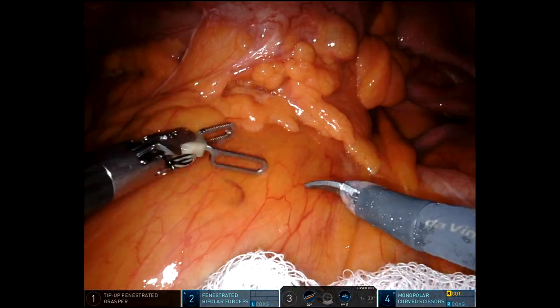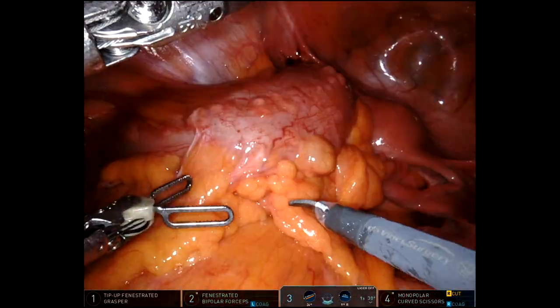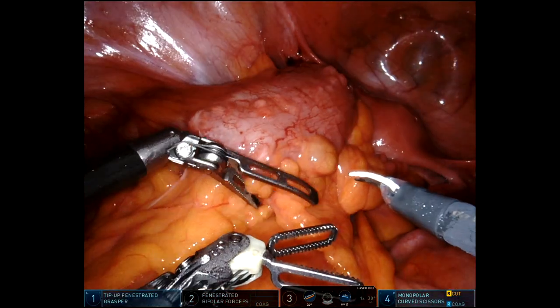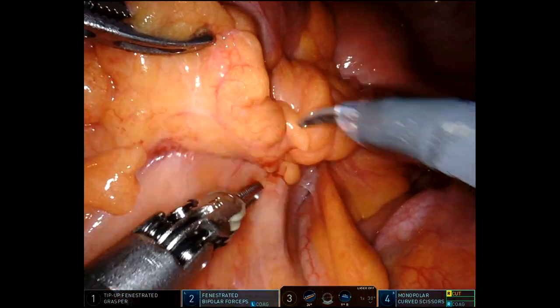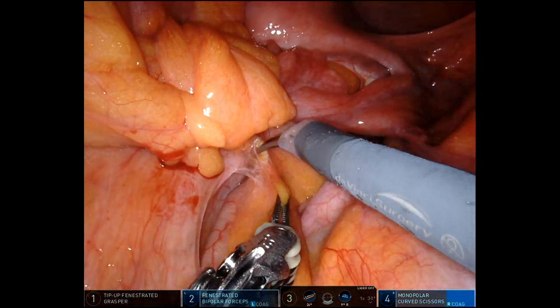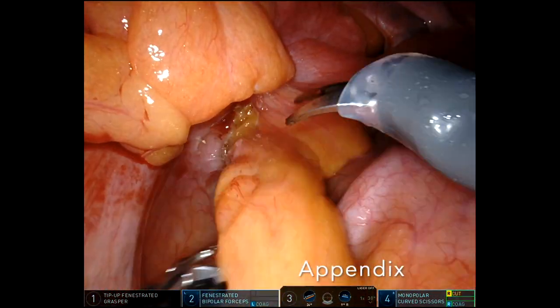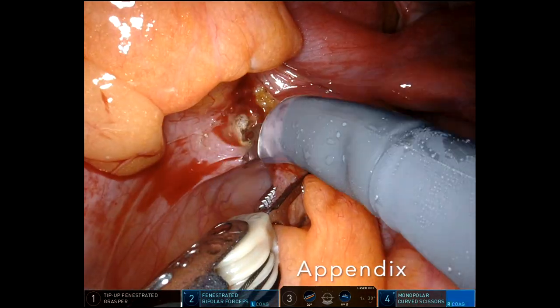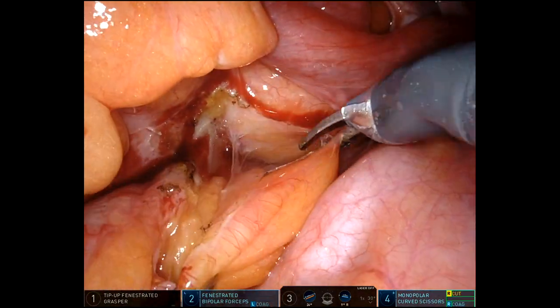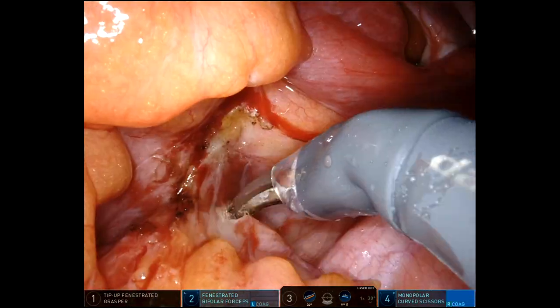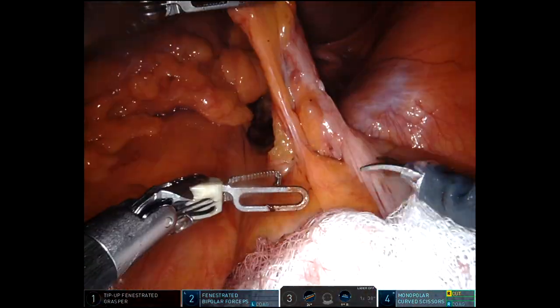This is a case of complicated diverticulitis. The patient had numerous attacks and has now developed a fistula, likely to the left fallopian tube, as well as what looks like on MRI a fistula to the cervix. She elected for resection.